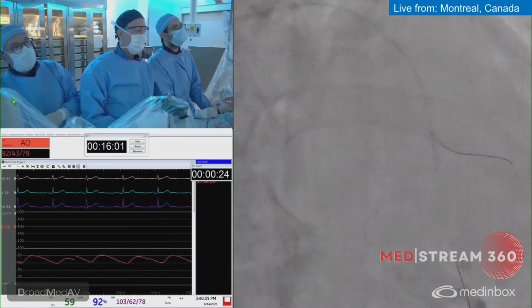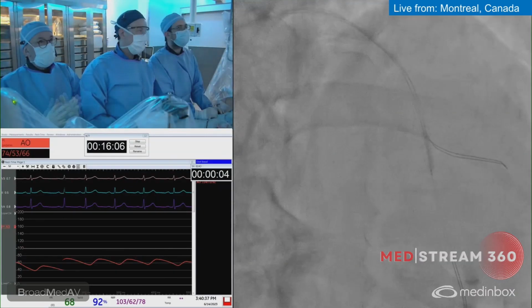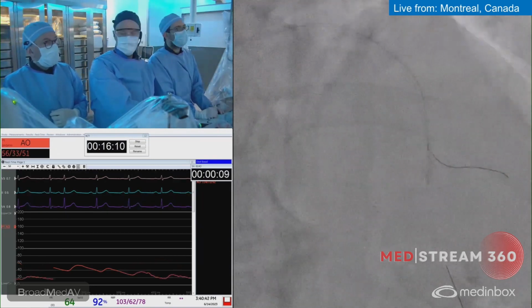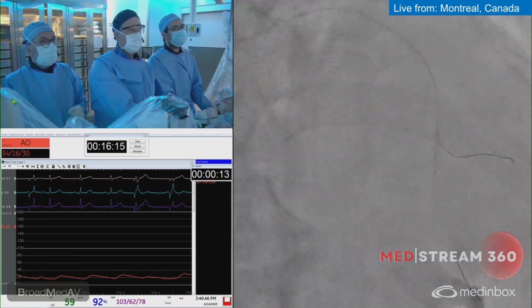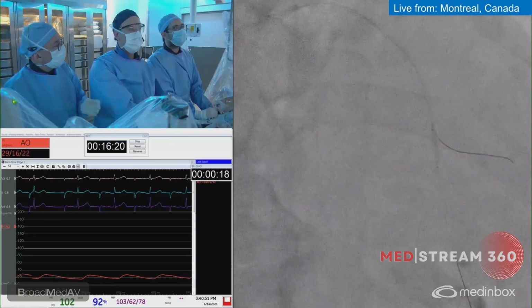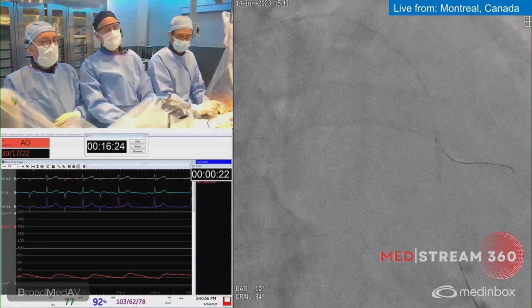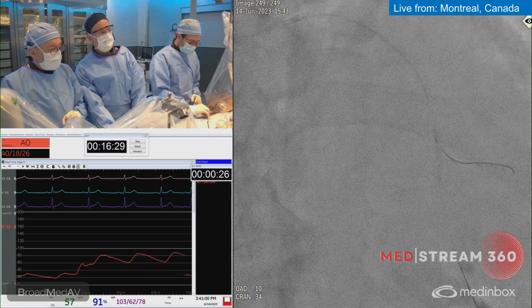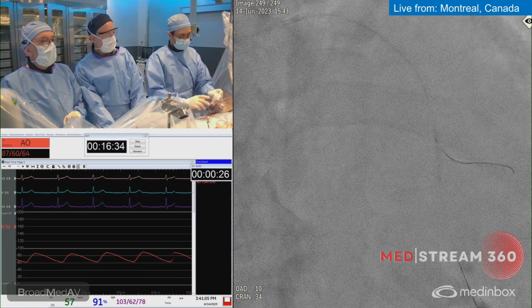Usually I go 4, 6, whatever, low pressure. Yeah. And then sometimes when you start, the balloon could open even bigger, but you see now it's good. Okay. Do the first round of shockwave. So you don't hear much, but you have the shock wave. Yeah. I usually do several. You can do 8 rounds of 10 cycles, whatever. 10 cycles, right? With one balloon. Afterwards, you cannot use it anymore.